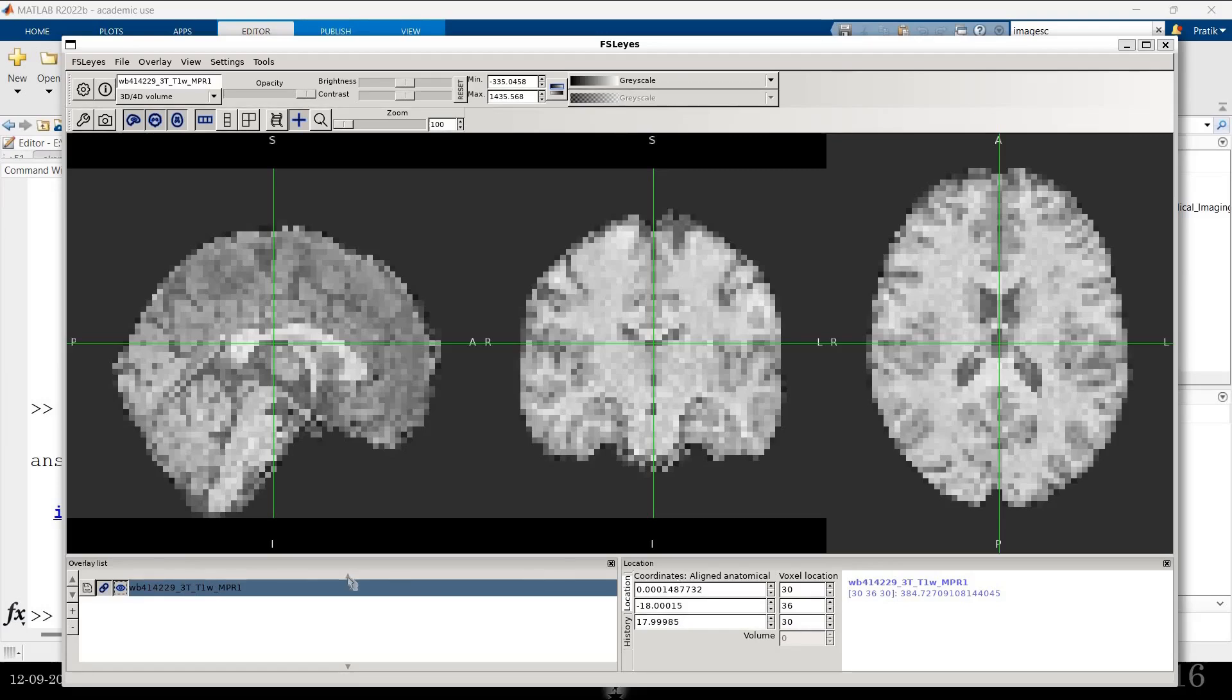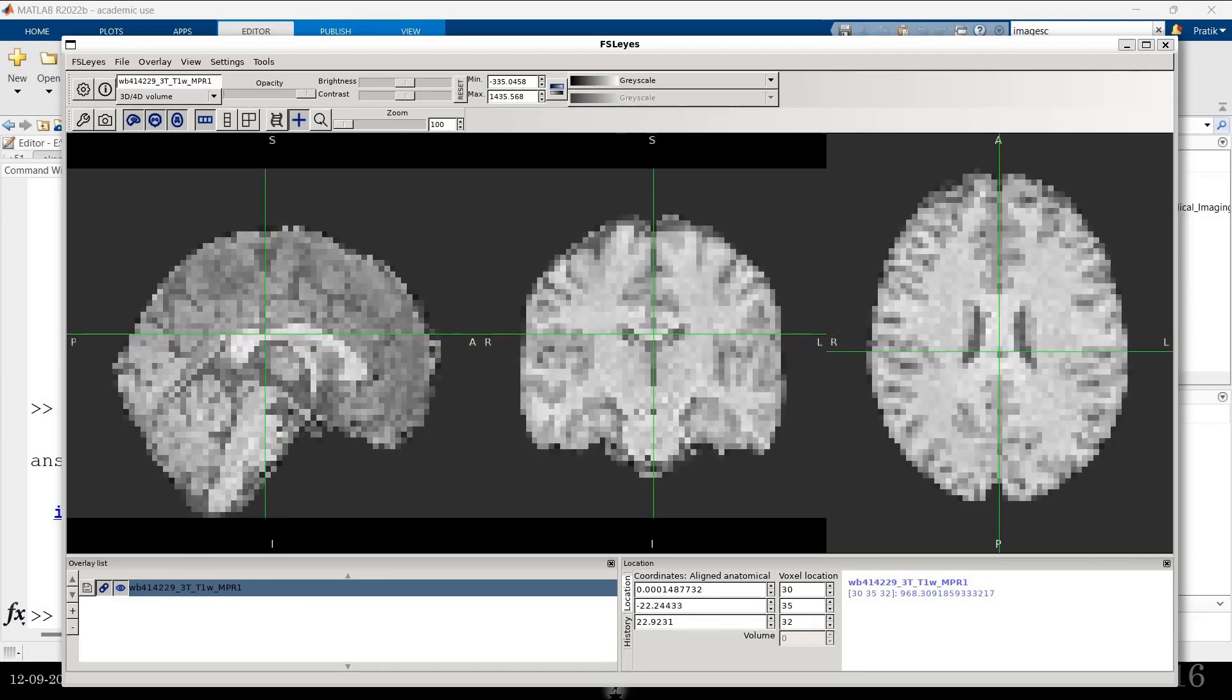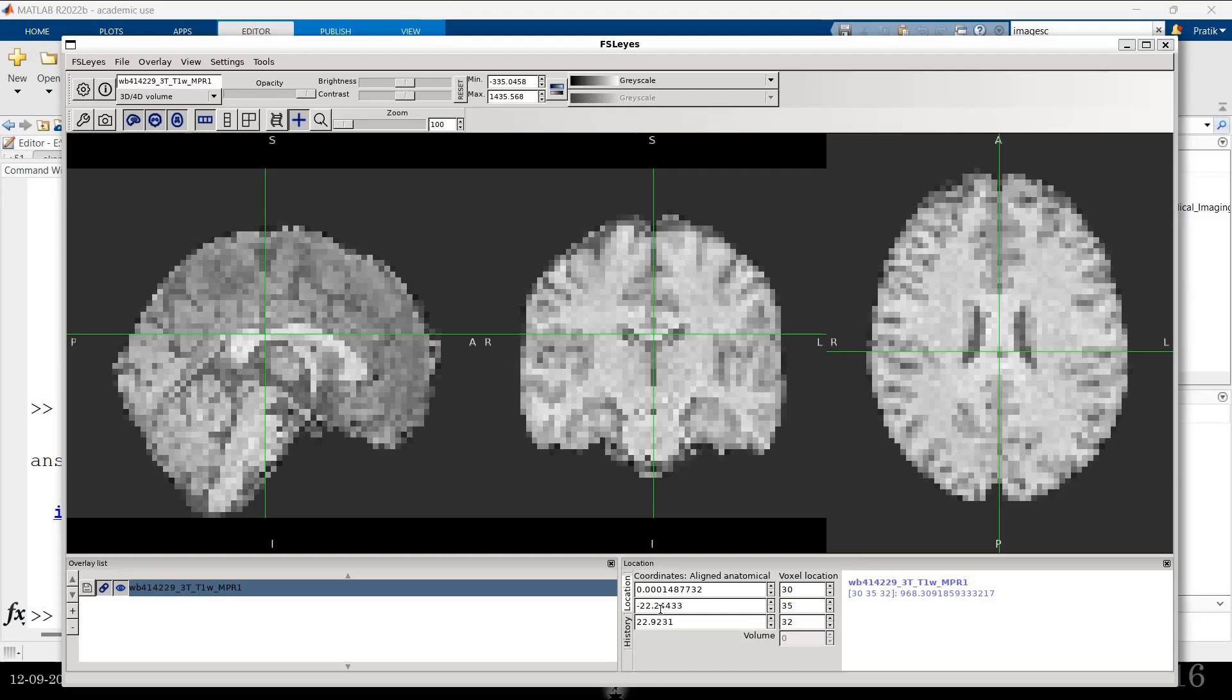Every voxel in the MNI space is labeled. Let's say if I want to go to corpus callosum. I know that these voxels, these voxels corresponding to the, these MNI coordinates correspond. The location corresponding to these coordinates is the location for corpus callosum.